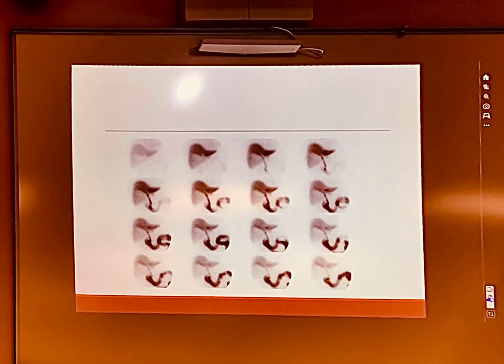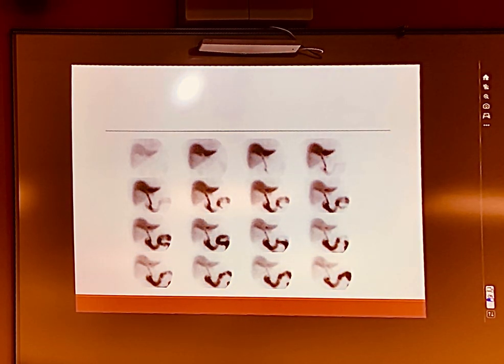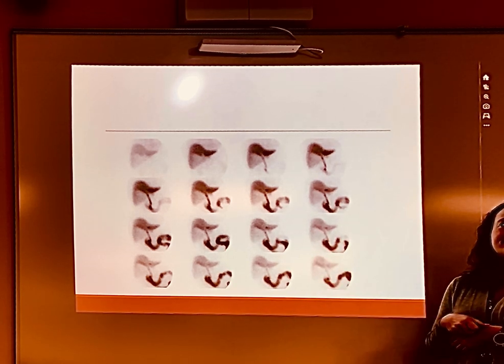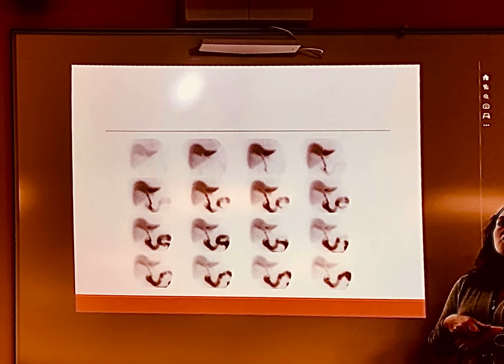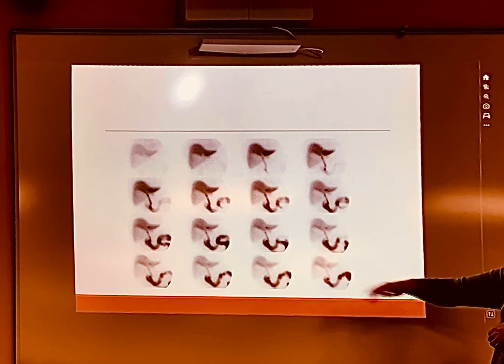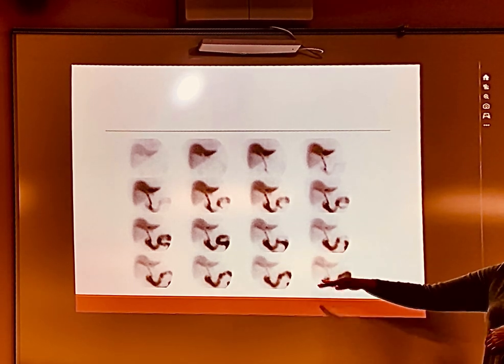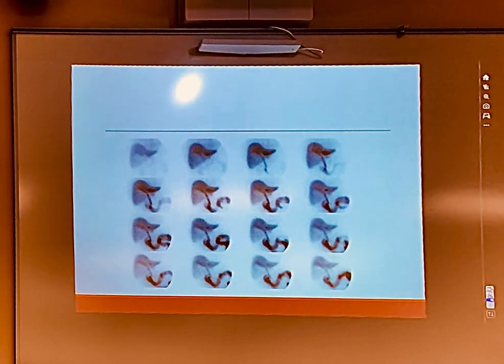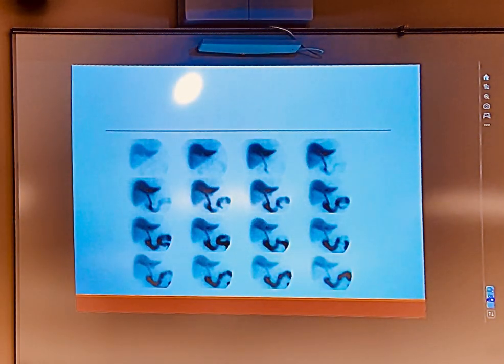Now, I will tell you, just from experience, you're not gonna get a 4-hour picture on this person. You better bring them down in 2 hours, because you're almost out of liver activity. Still no gallbladder. If you bring this patient down another hour, you're gonna have nothing, it's gonna be all bowel. And then you're done regardless, because you can't image anymore. It won't go backwards.